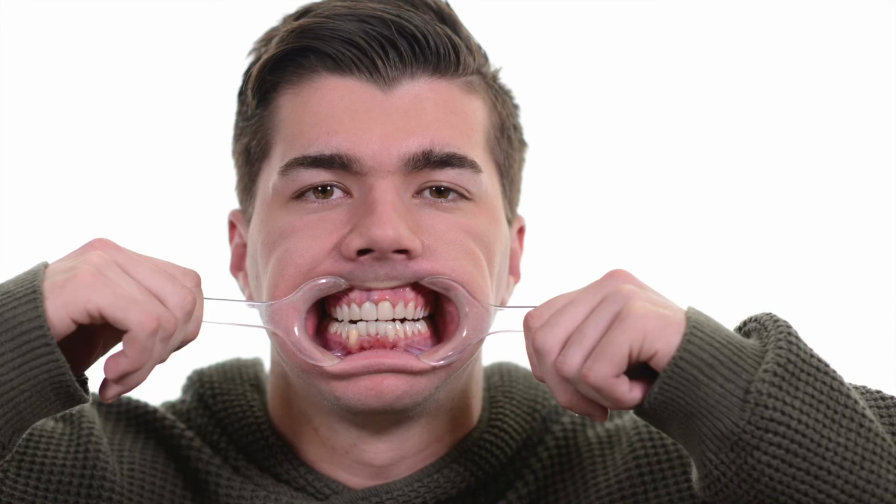After that, we've done some preparation on Cameron's teeth, and what you can see here is he's very numb in this photo, but what we're again checking is whether the first trial smile that we have put in his mouth is correct. And this is when his teeth have been prepared, and we've put a trial smile over the front of his teeth. You can see him smiling here, and that's just a video. Again, his upper teeth are very, very numb.